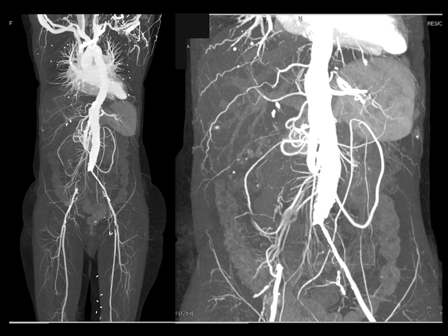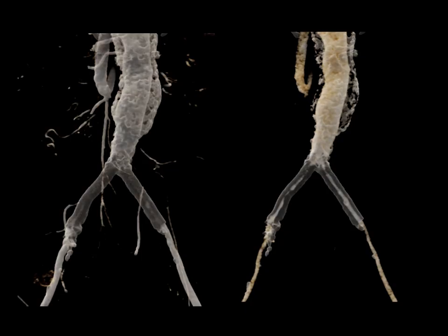And then here I go to MIP, and look what happens on the MIP. It looks like the patient's right common iliac artery is occluded. The left looks patent, but the right is not. So did I miss something? Is this correct? Should I call up the doctor and say right common iliac artery is occluded, the stent is occluded? Well, you see what happens is at times when there's a stent present, it can confuse the computer.